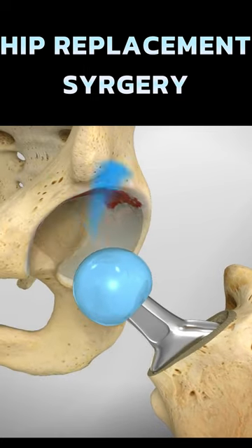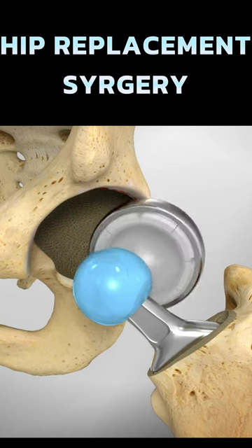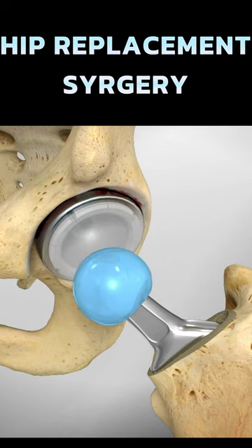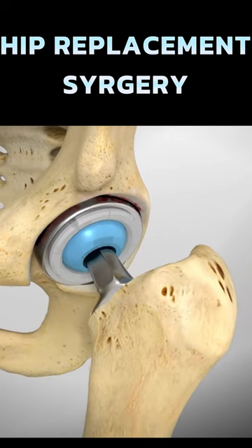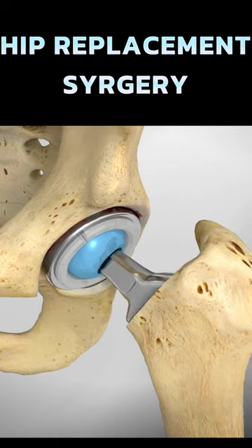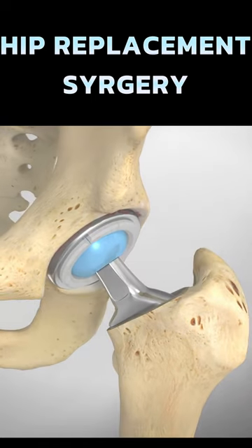The damaged surface of the socket is smoothed in preparation for the insertion of the new socket. Then the ball and socket are joined. Once the surgeon is satisfied with the fit and function, the incision is closed and covered with dressing.